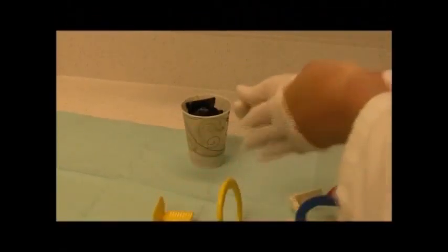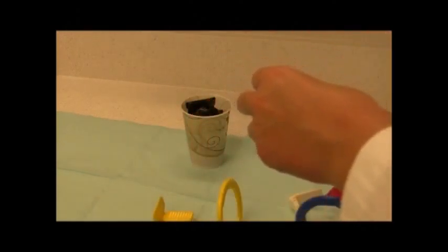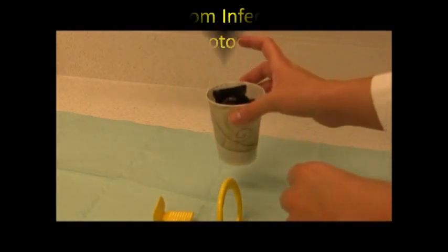When you're finished with your radiographic procedure, remove your gloves and take your clean cup to the scanning room.